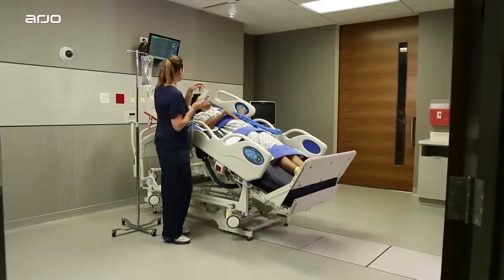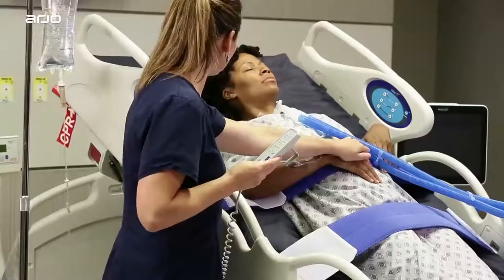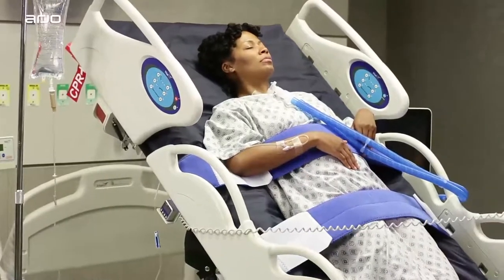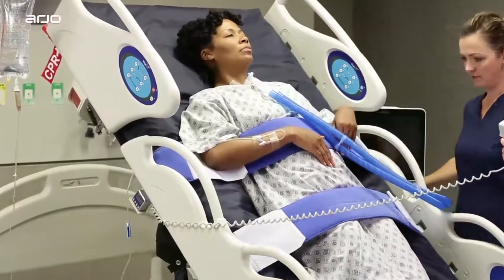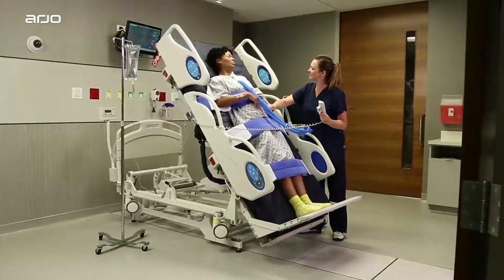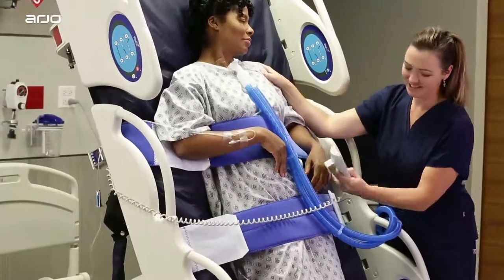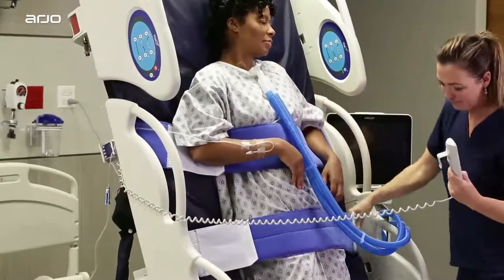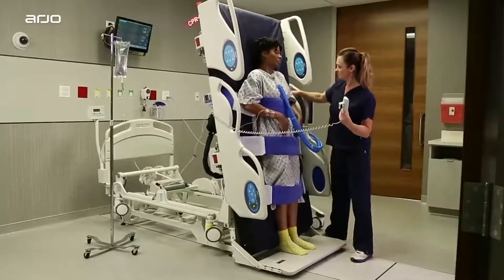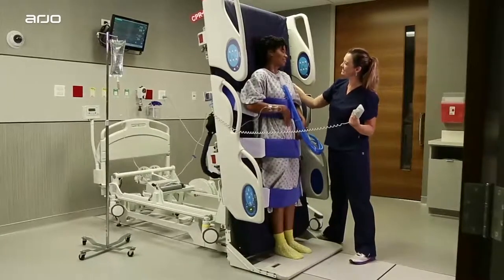This gradually and gently moves the patient into a full standing and weight-bearing position, helping the patient smoothly progress to sitting, standing, and out-of-bed activities. The key advantage of progressive tilting is that it helps the patient get into a standing or weight-bearing position, but it doesn't have to happen all at once. For example, if a patient can only tolerate 30 degrees of tilt, they can still benefit from partial weight-bearing and partial upright posture until they are ready to progress further.